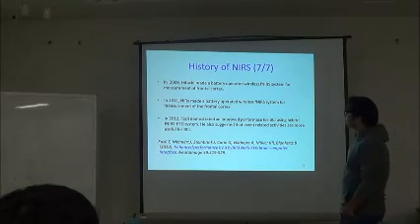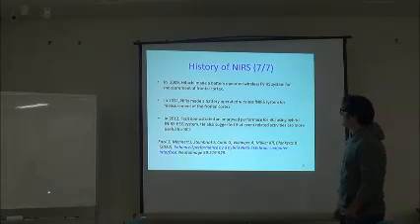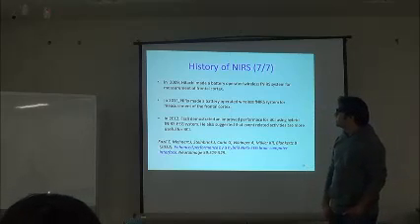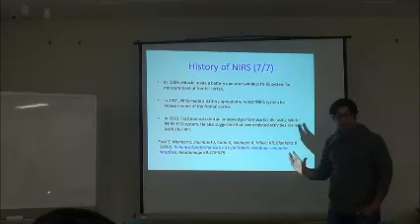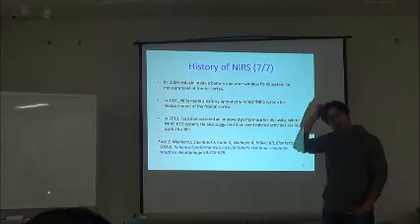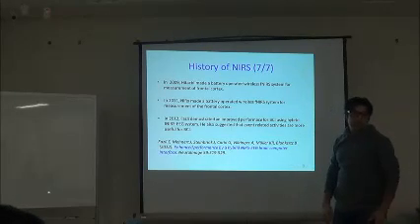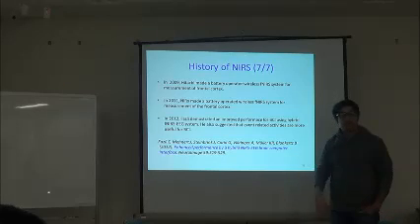And after that, in 2009, Hitachi made a battery-operated wireless NIRS system for measurement of the frontal cortex. Battery-operated wireless systems are very small, and the good thing is that they are portable. But the bad thing is that usually it's not possible to put them on the motor areas. They are good for the prefrontal areas. We have one wireless system; we can use it for the prefrontal cortex, but not for the motor one.